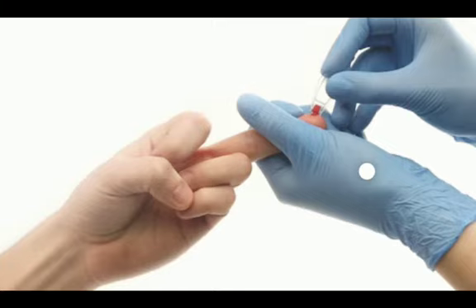And this will lead to a false increase in the determination of potassium and magnesium levels. So if we want to determine the level of potassium and magnesium in the blood, we have to prevent the patient from pumping the fist.